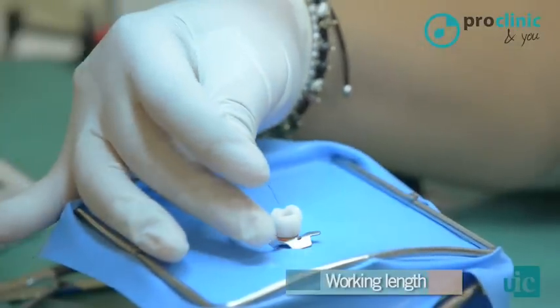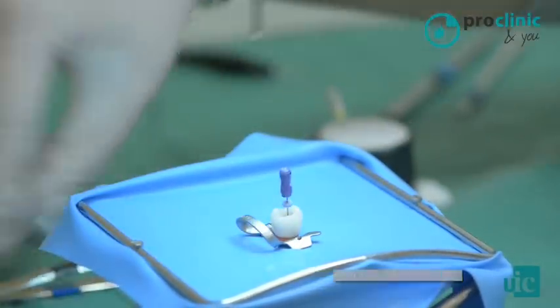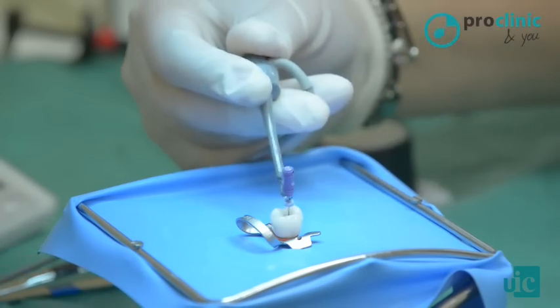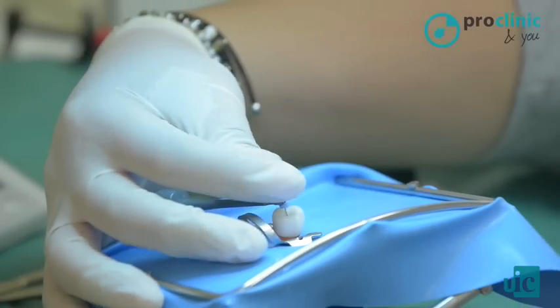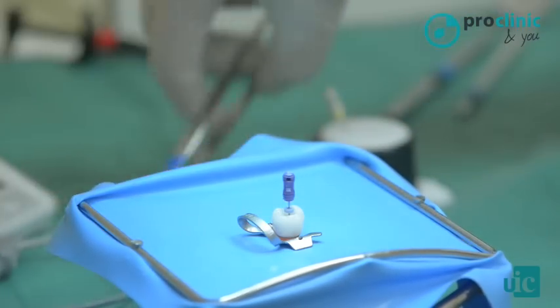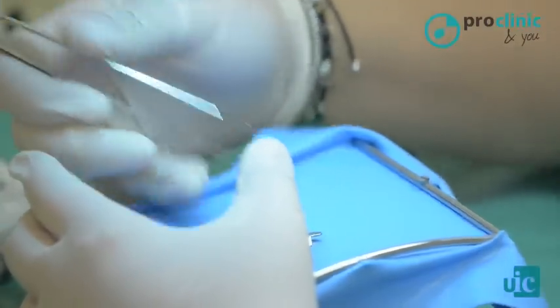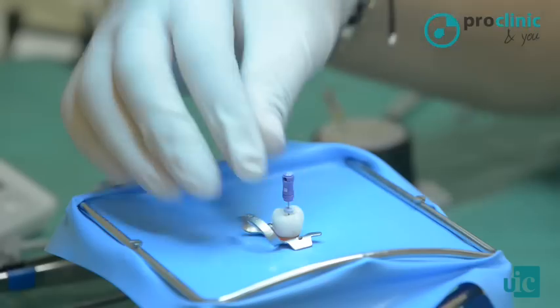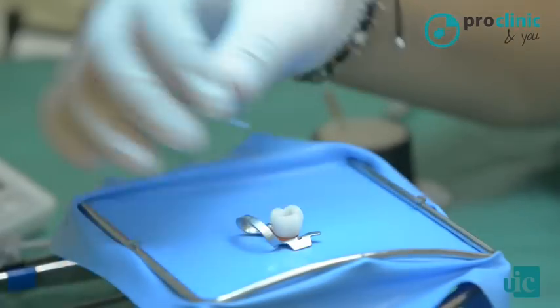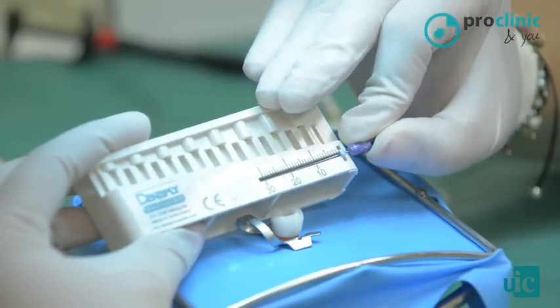When the canals are located, we can introduce the files. And helped by an apex locator, we should determine the exact canal length. We are going to set a rubber stop at a reference point, for example, at the cusp of each canal. We need to establish, with the help of a ruler, the exact length of each one.